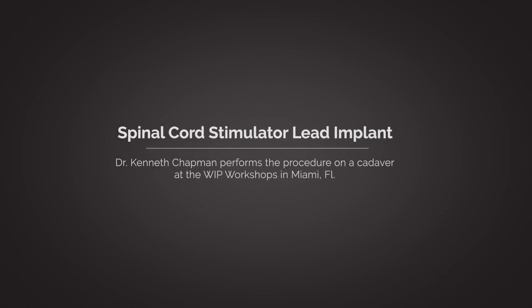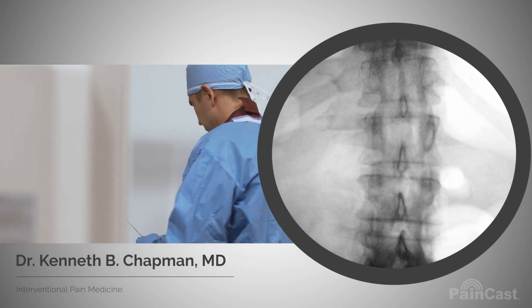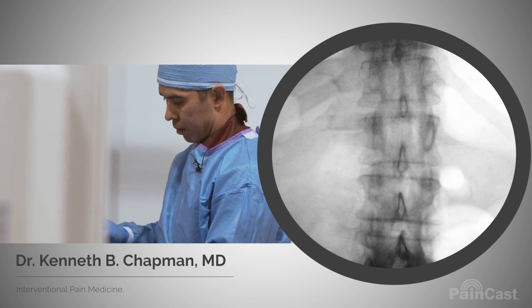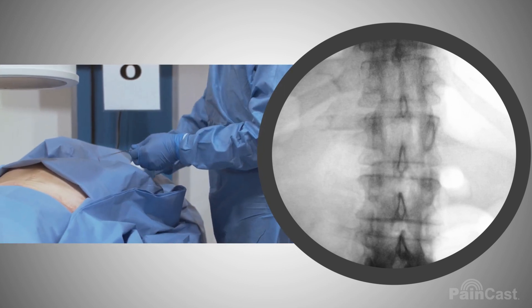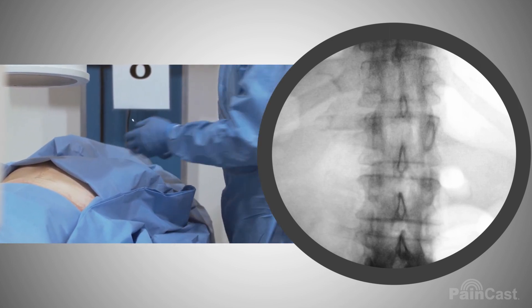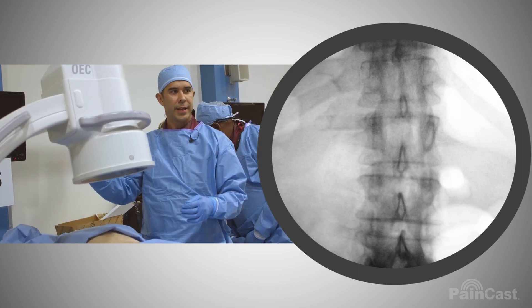We're going to go into the right L1 frame. Can we angle to the head a tiny bit?